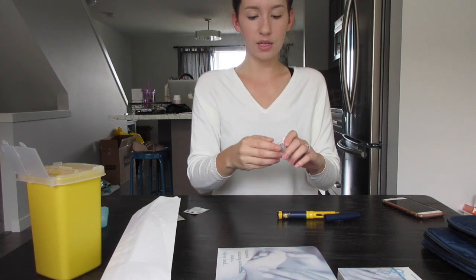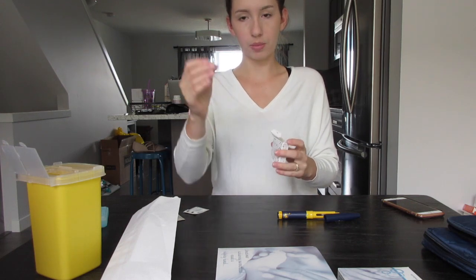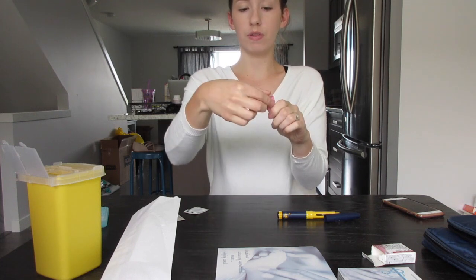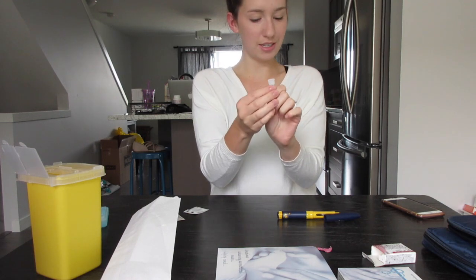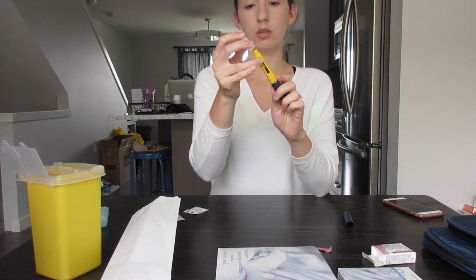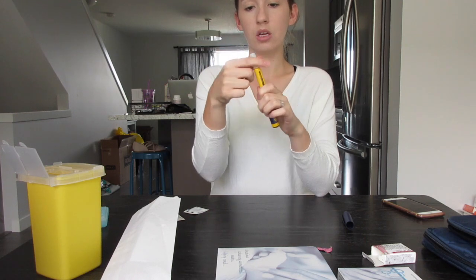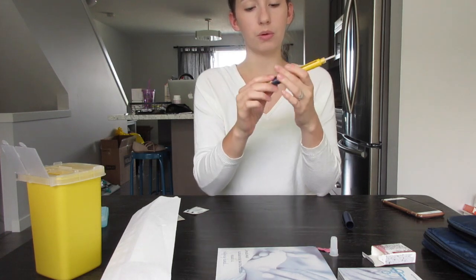So the Puregon has these needles that come in a little box. There are three in a box. They look like this. So this is already sterile. So all you have to do is peel off the tab like that. Obviously don't touch it. And then we are going to screw this onto the pen. So we just push slightly and then screw. Now this one has this cap and it also has a cap underneath. So when you pull this cap off, you still have a protective cap so the needle isn't exposed.